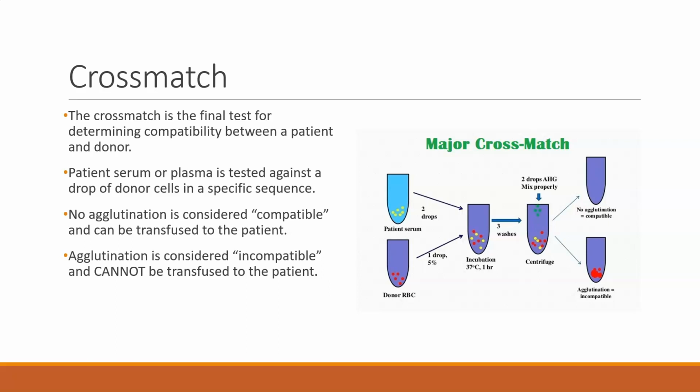And then after incubation, there's a procedure where we wash and add a special reagent, and no agglutination is considered compatible and can be transfused to the patient as long as the antibody screen is negative. Agglutination is considered incompatible and cannot be transfused to the patient.